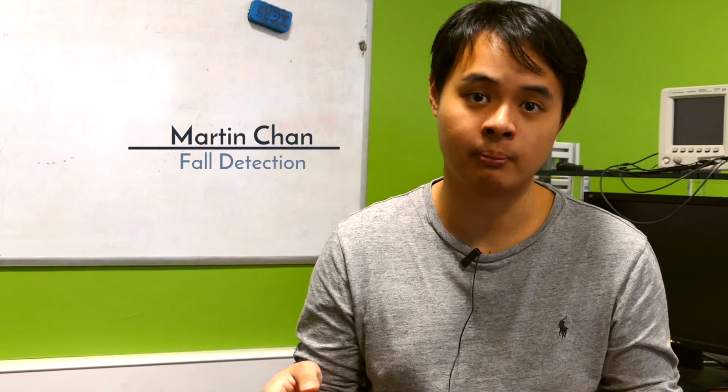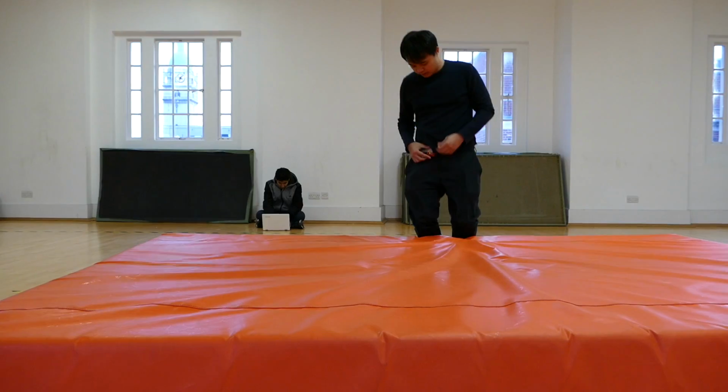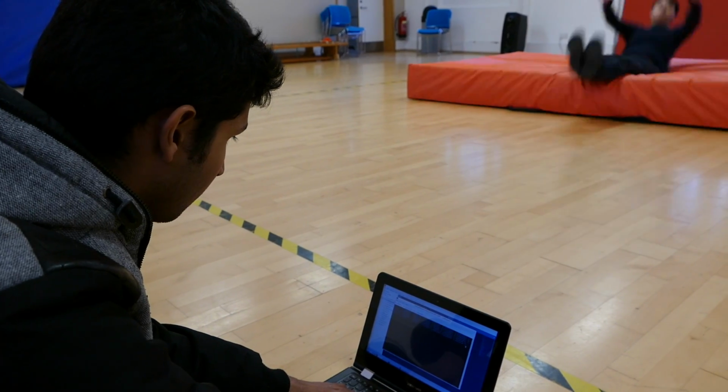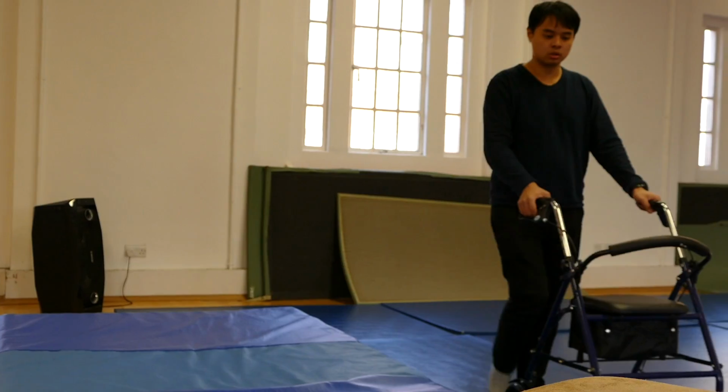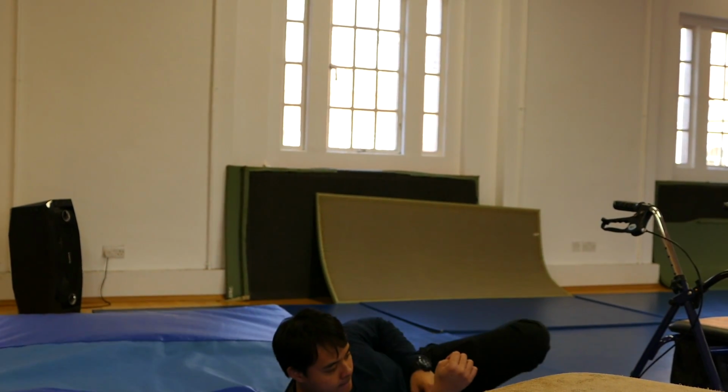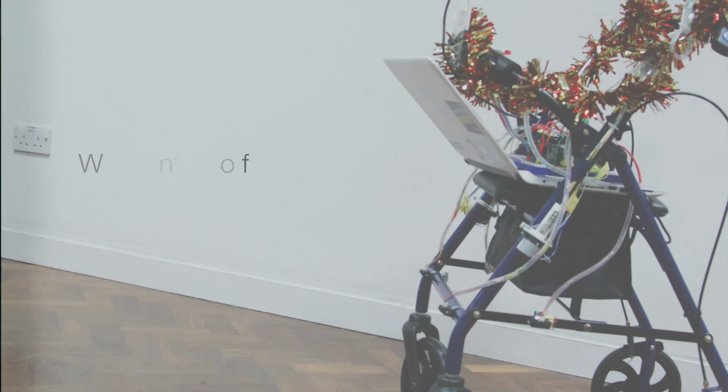We are designing a walker which is really smart. It's able to basically stop old people from falling, and if they do, stopping them from being severely injured. The product is going to be very important, I think, in demonstrating ways that robotics and computers can be used to solve real problems. In our case, it's the problem of assistive walking.